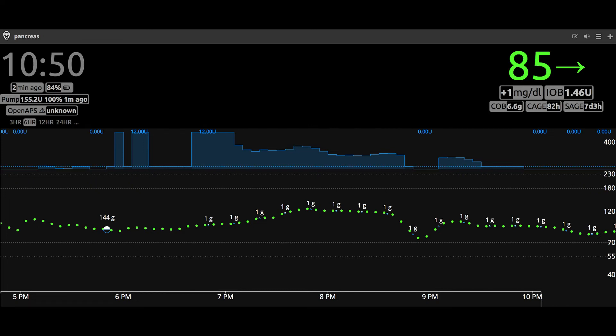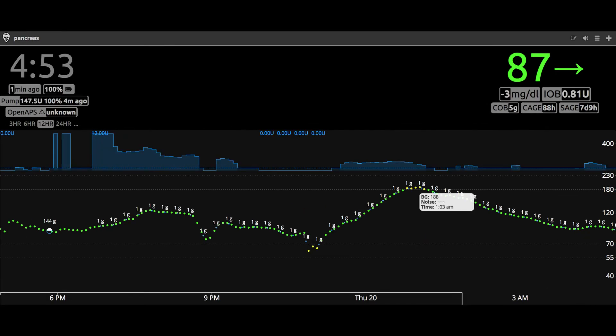Here we are at 11 hours later, and you can see there was quite a spike that started about five hours in — it did go up to 188, which is higher than I'd ideally like. But if I wasn't using this 10 extra units of insulin provided by the square wave, I would probably be at three or four hundred by now.